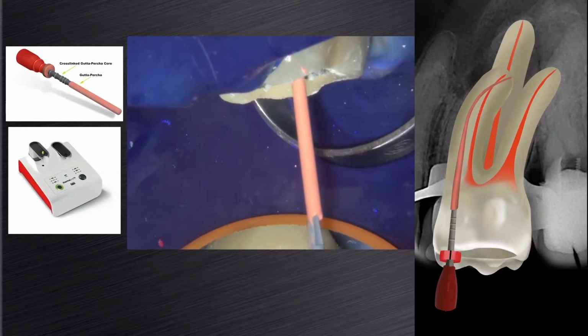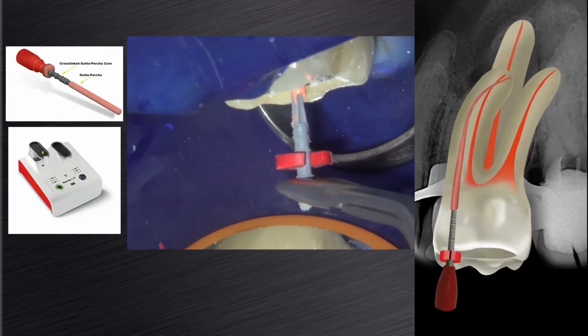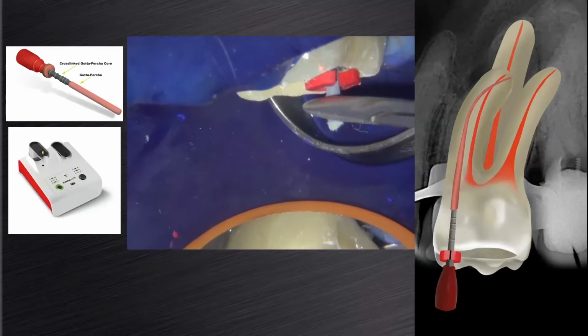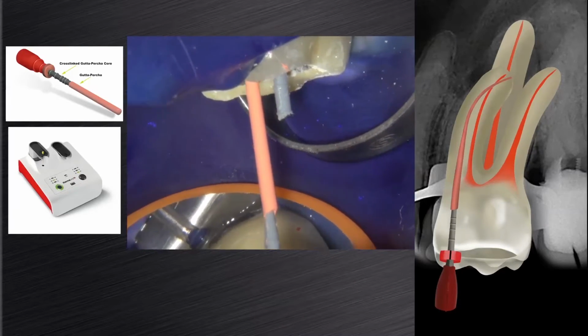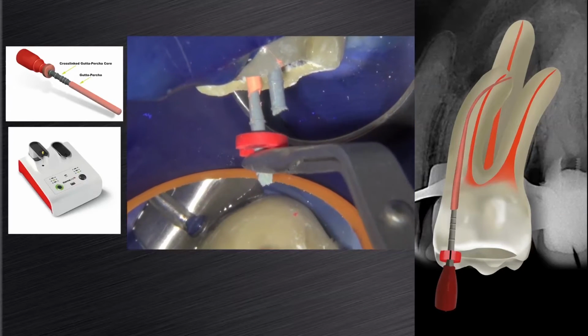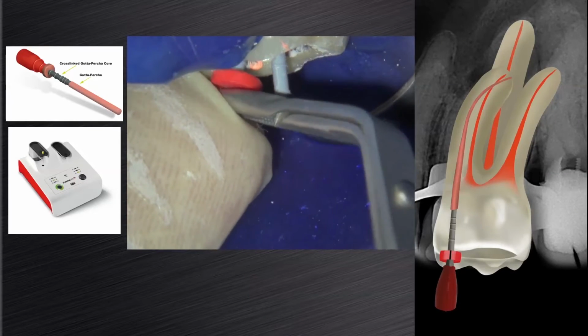On this slide, you can see the obturation of the two mesobuccal root canals with size 25 GuttaCore obturators. Note that the obturators are placed in slow motion, about 4 to 5 seconds of travel as we obturate each canal.